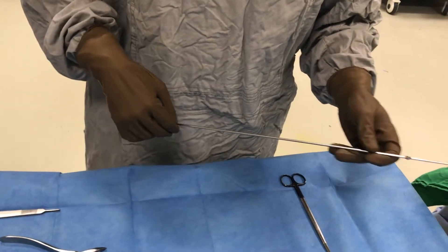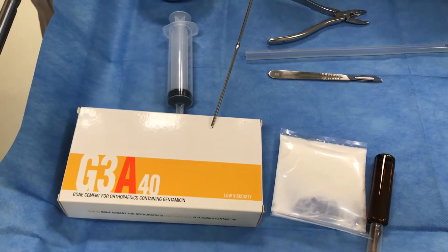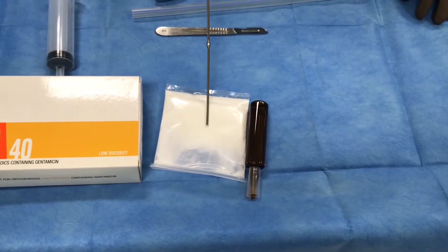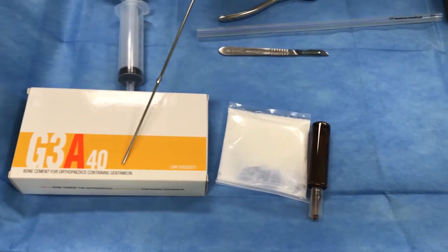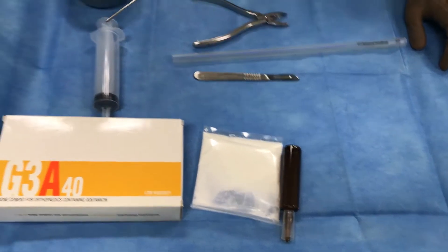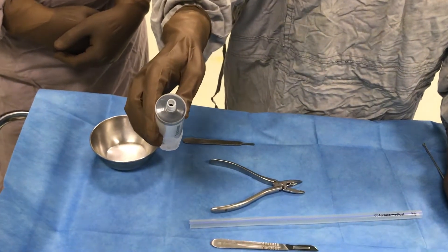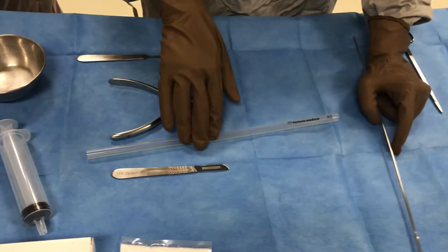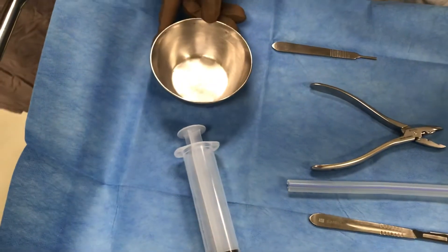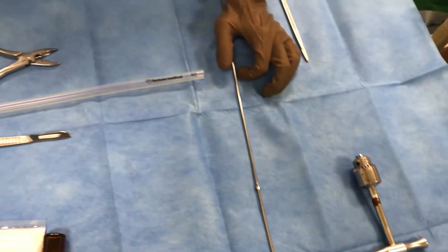A plain wire can be used as well. We need a cement which is preferably a low viscosity type, as it gives us more time to work with it. It includes powder and solvent. To prepare a strong antibiotic cement — it already includes gentamicin — you can also add vancomycin, which is a heat-stable antibiotic. We also need a large Bulb syringe (cut to provide a larger opening), a large bore chest tube preferably 36 French or larger, a gully pot to mix the cement, a surgical blade, and a wire bender to provide a hook at the end for easy extraction later.